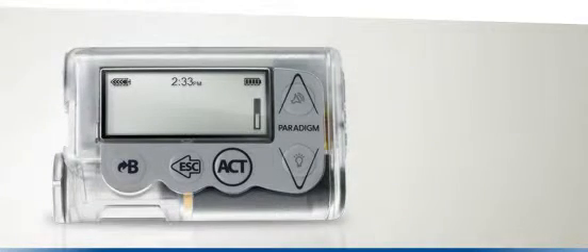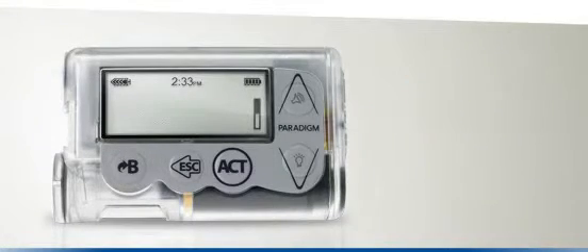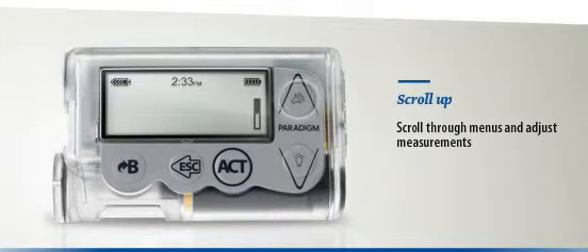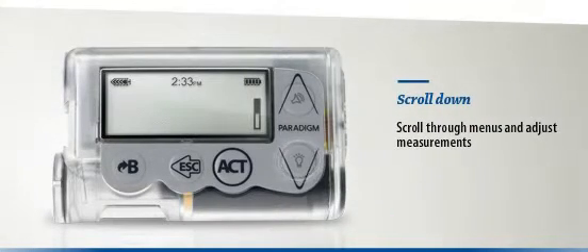Let's demonstrate just how straightforward it is. Pressing the B button allows you to administer and express bolus. Pressing the Act button allows you to make on-screen selections and confirm information. Pressing the Escape button allows you to return to the previous screen and to access the main menu. With the Up and Down arrows, you can scroll through your menu and sub-menus and also make therapy adjustments. The Down arrow also allows you to activate the backlight when pressed at the same time as the bolus button.